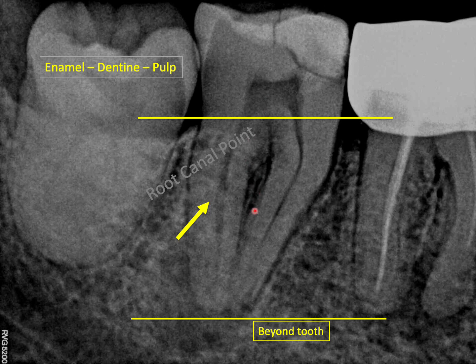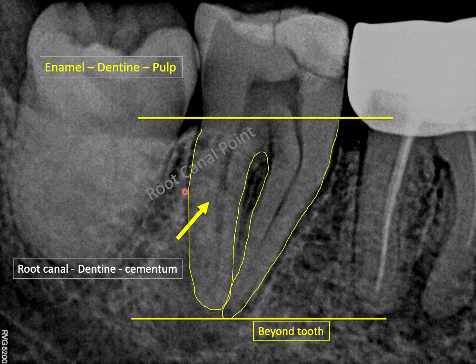For the root, I do the opposite — I start from inside and travel outward. I begin by tracing the root canal from the pulp chamber all the way to the tip of the root. Once the root canal is traced, I look at the dentine, then the cementum. So for the root, we move from inside outward, whereas for the crown we move from outside inward.